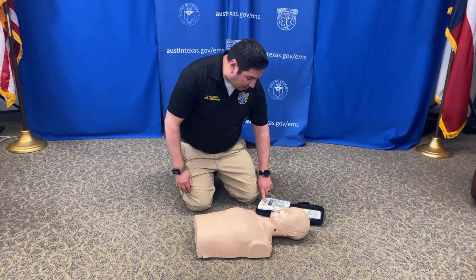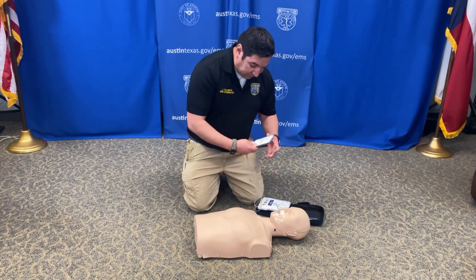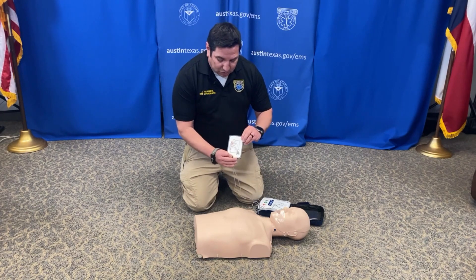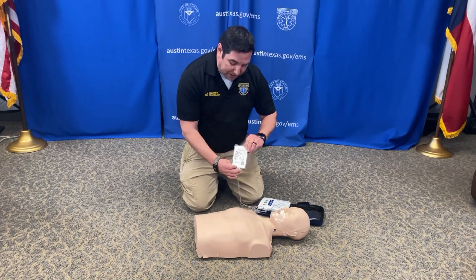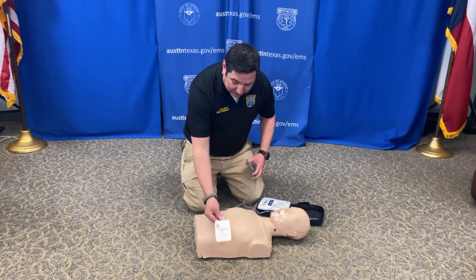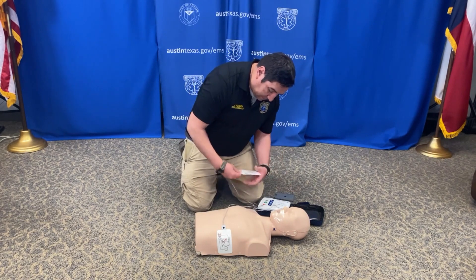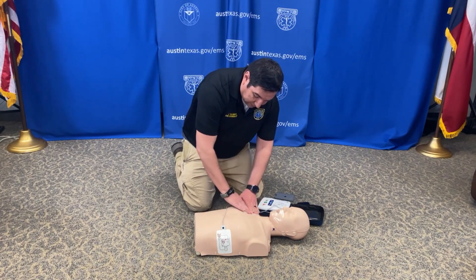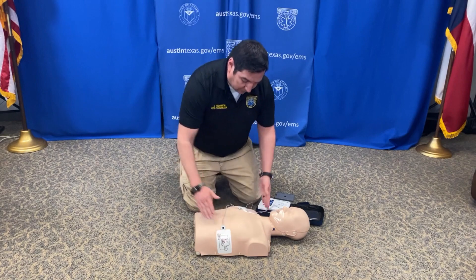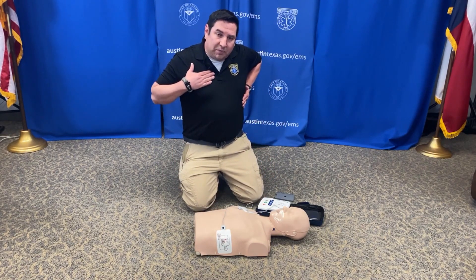Open up your AED and turn it on if it's not on. Adult patient — if the patient is a child, your pads will show you where the pads go. Remove clothing from the patient's chest for a complete bare chest. Remove the packet and apply the pads, pressing them firmly on the skin. One pad will go up to the right top; the other one will go right here just below the armpit.